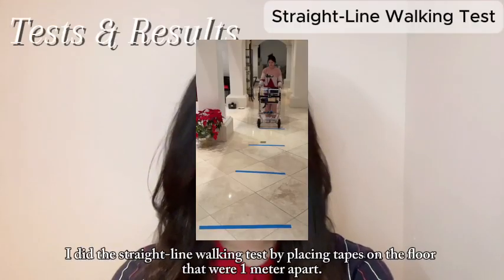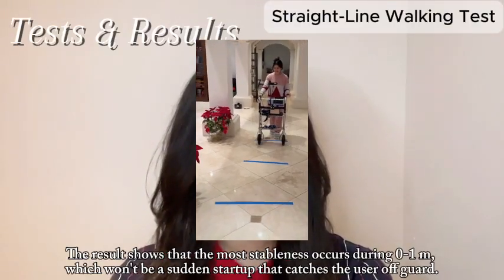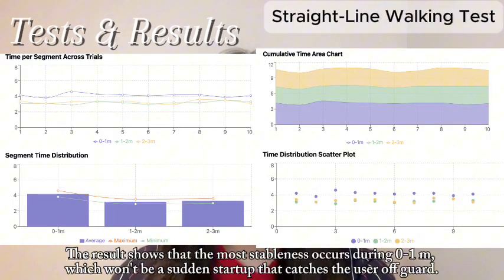I did the straight line walking test by placing tapes on the floor that were 1 meter apart. The results show that the most stableness occurs during 0 to 1 meter, which means there won't be a sudden startup that catches the user off guard.